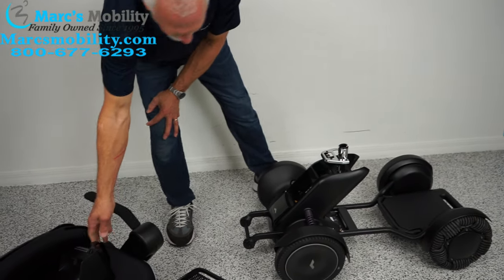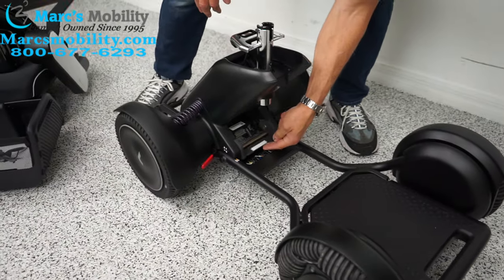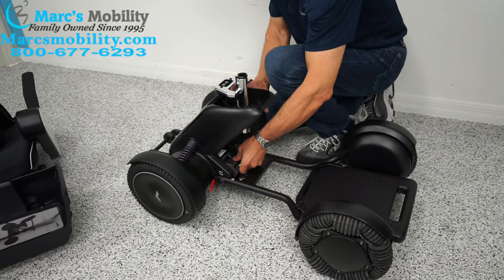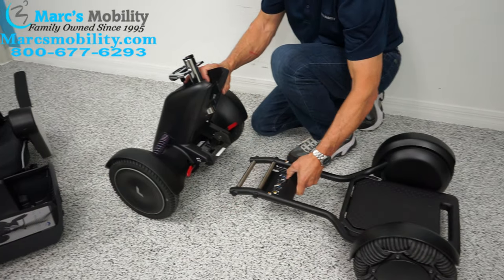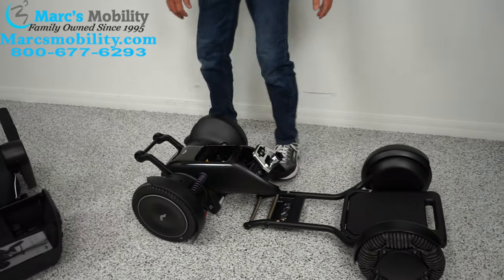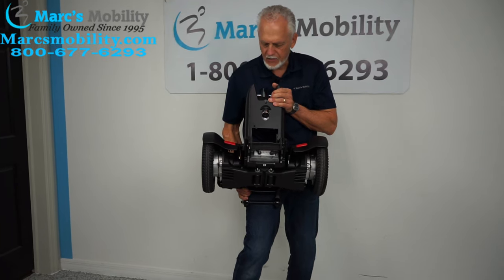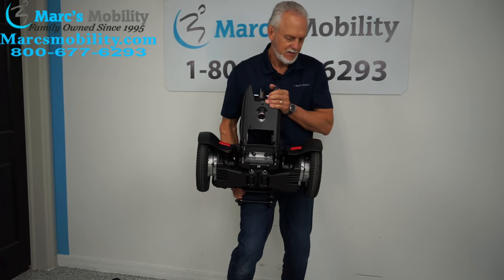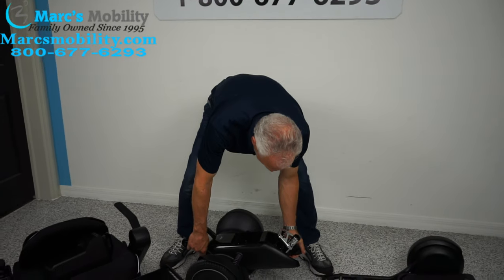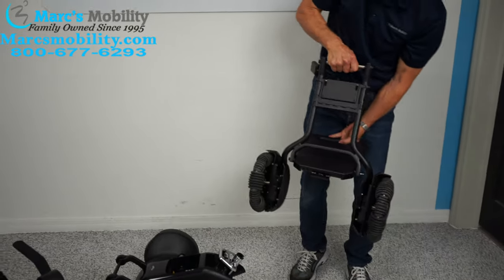When the battery pack is off, you can see in the front right here there's a little lever. I'm going to pull that lever up and pull this section out from here. Now you've got your base — probably the heaviest piece right here — and your front end.